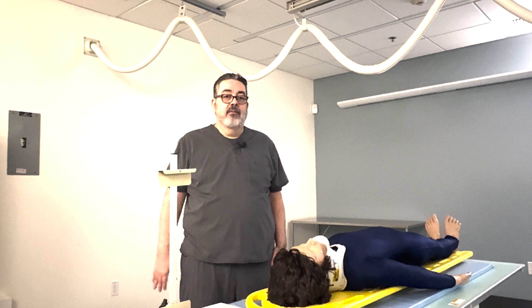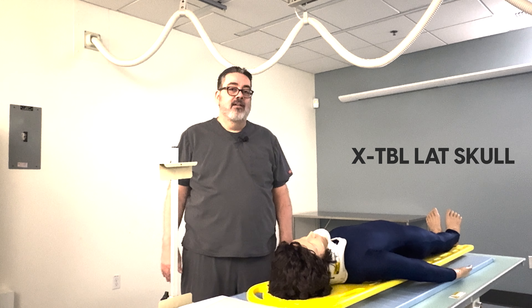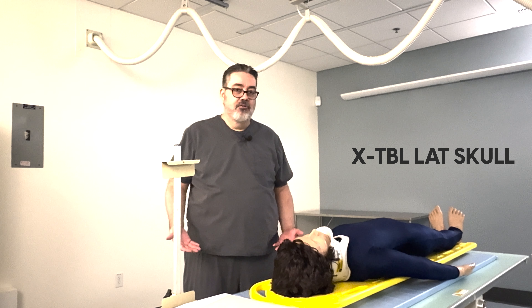Now we're going to look at a lateral skull, but for trauma, obviously, we need to do that cross-table so that we're not moving the patient.